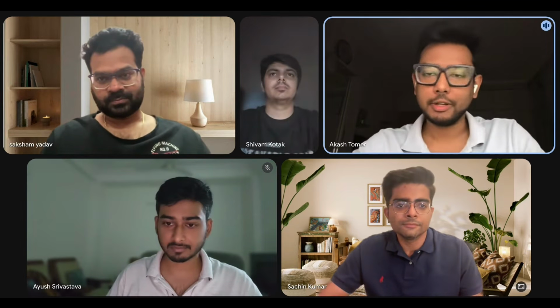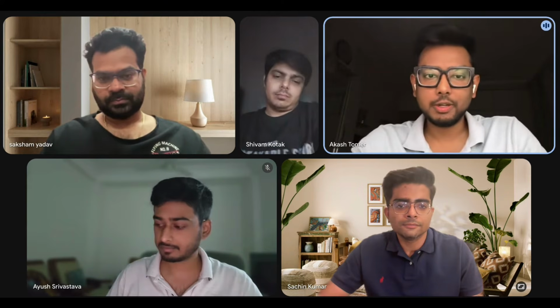Hi, I'm Dr. Akash. I'm the co-founder of Quillr, an AI reporting platform. Quillr is an AI-powered reporting platform that is designed to emulate a human assistant. Reporting with Quillr almost doubles your reporting output compared to any traditional methods like manual typing or even speech-to-text software. I'll brief a little about how it does that further down in the video.